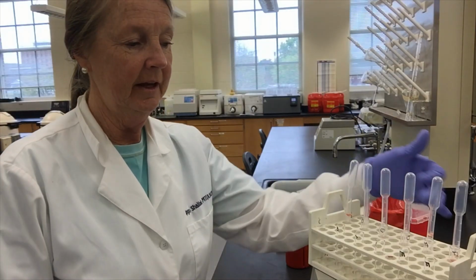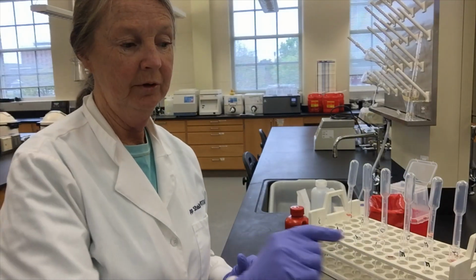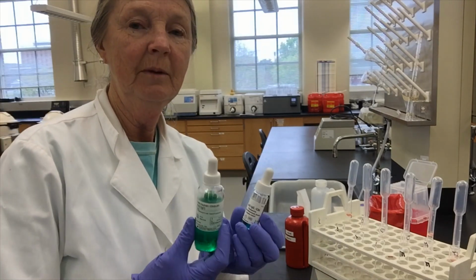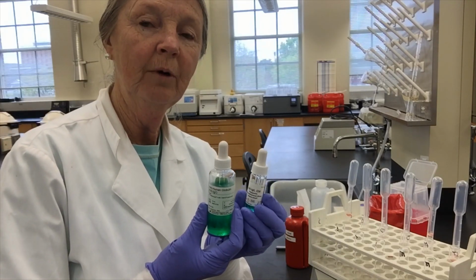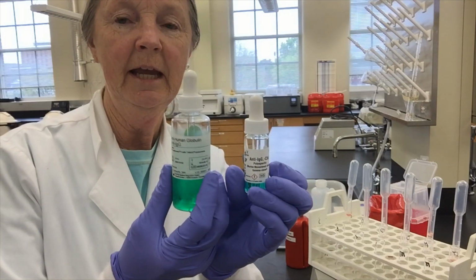So when you read, I've washed my cells 3 times and I've made a 3 to 5% suspension. I have a tube up here labeled the same, A through F. When you read your procedure manual, it talks about now is when we're going to put in our 2 drops of AHG. I have 2 different kinds of AHG in my hand.